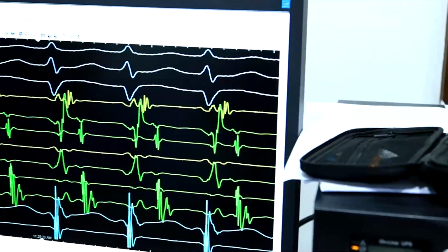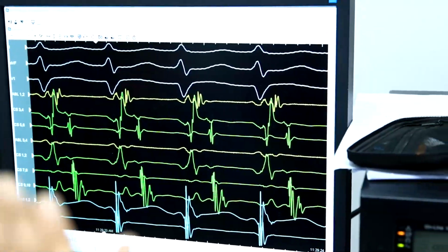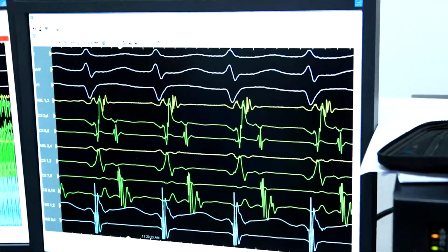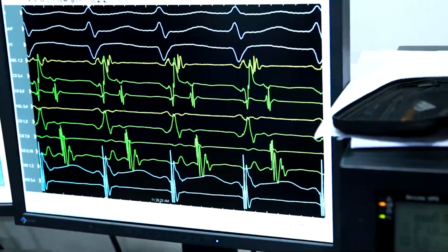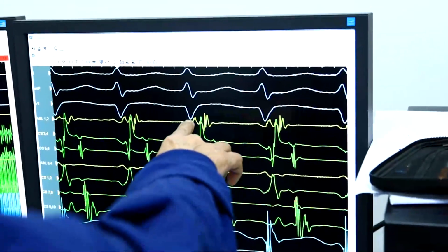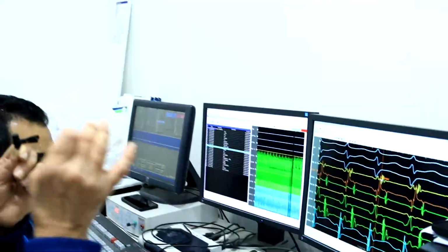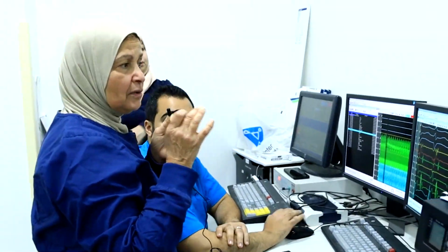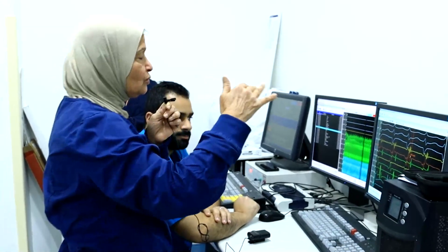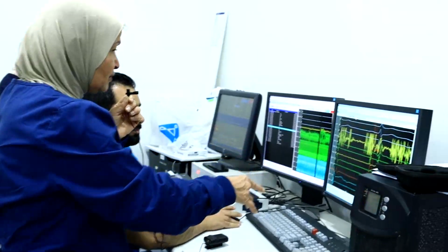Now I went to the left side. I said, okay, we finished with the AVNRT, and now I'm going in. I was thinking in the beginning that this is an atrial tachycardia, and I have to get an atrial signal before all these A signals. Actually, I succeeded, and I terminated the tachycardia once at a site. I will show you on the fluoro. Yes, this is terminated.